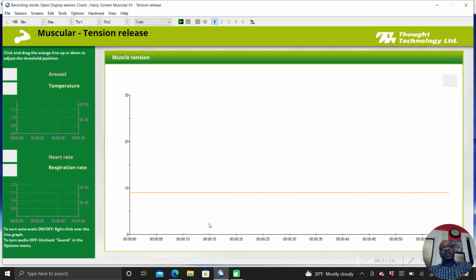It can allow you to have better quality EMG readings, because when the impedance is low and balanced, meaning that it's even amongst the three readings that you get, then your equipment is better able to reduce artifact or external noise that you might pick up from the environment, from equipment that's surrounding the area, and those kinds of things. So it can be very helpful to have the impedance test, and it doesn't cost that much more.